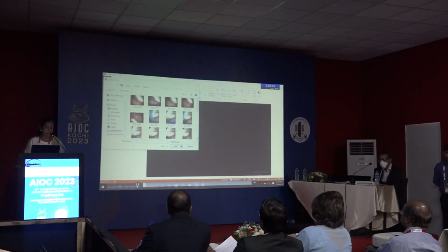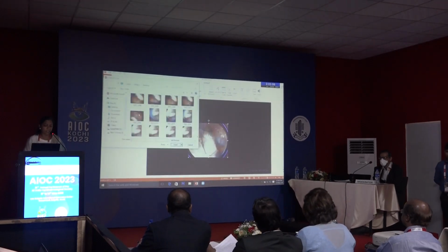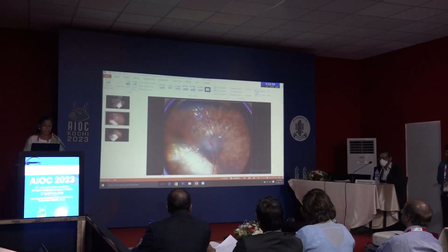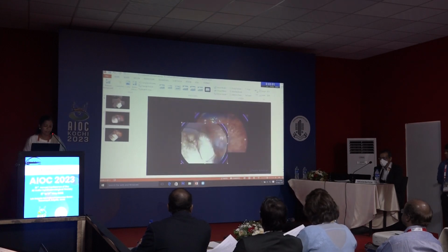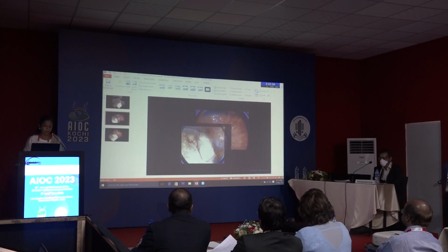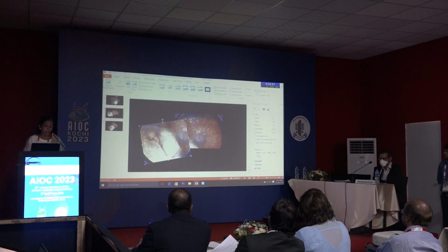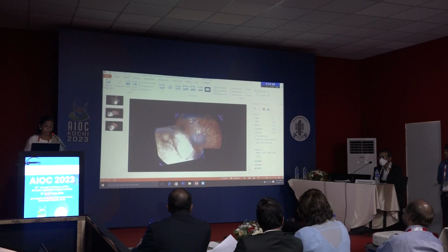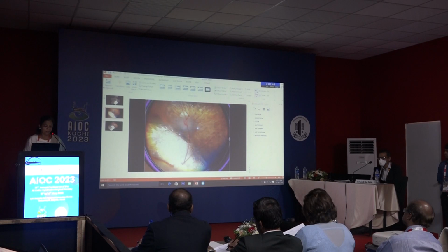on PowerPoint, the central image is captured, reduced in size, and brought to the center. The peripheral image is selected, reduced in size, cropped, and taken backward behind the central image. The central image is further cropped and rotated to align the disc and the vessels. Another peripheral image is selected, rotated, cropped, and taken backward behind these two images.